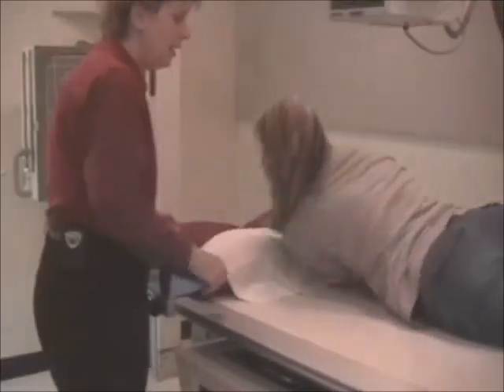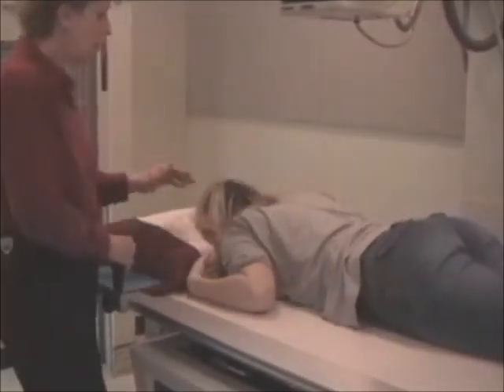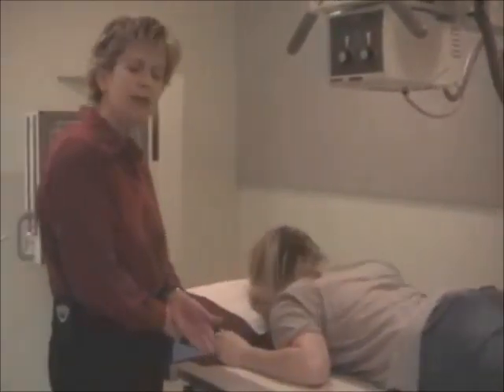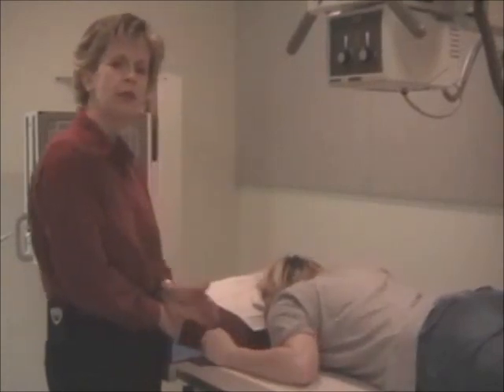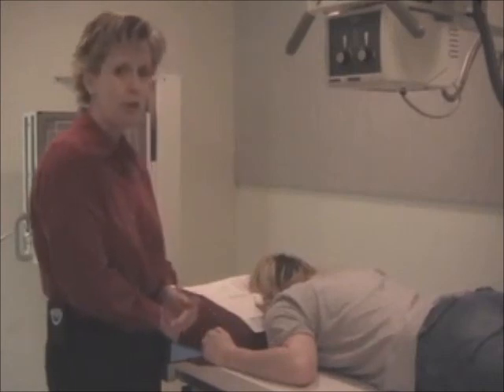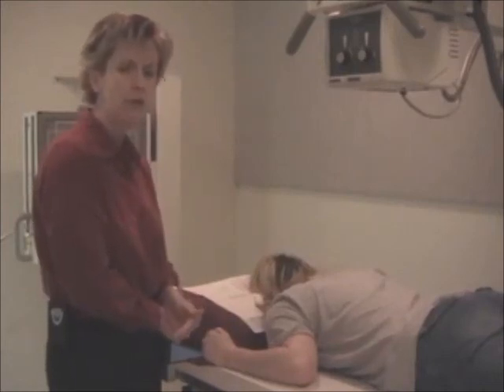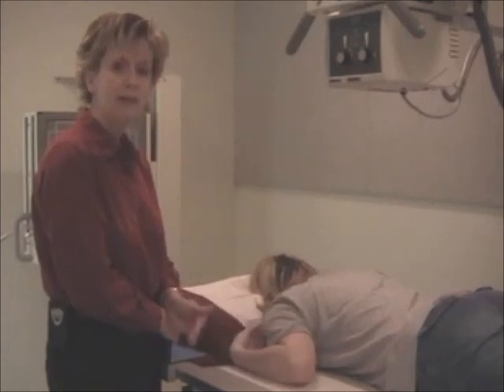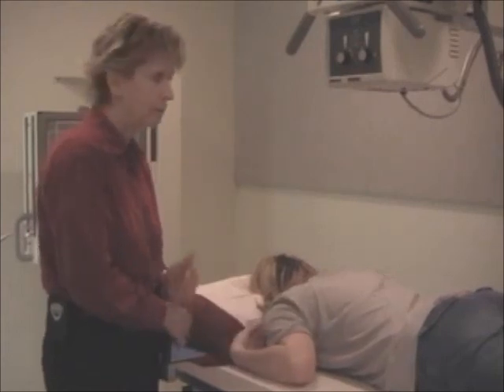So we're going to pretend that this one's our 15-minute follow-through. And we're going to have our patient be onto her stomach. If you're not doing a small bowel follow-through, but the protocol calls for a 14/17 of the stomach, try to do that one near the end of the procedure, because the purpose of the big film is for small bowel. The purpose of a big 14/17 film is not for the upper GI, it's for the small bowel. And the small bowel is distal to the stomach.